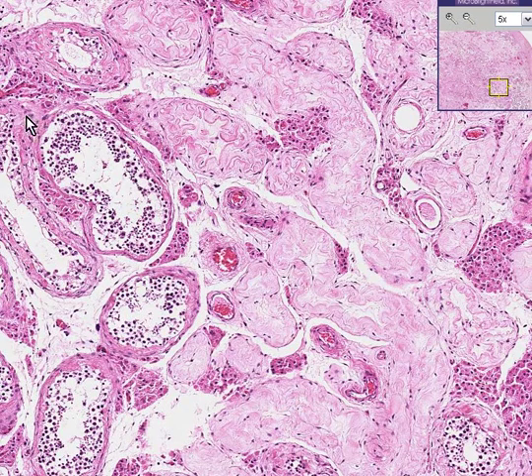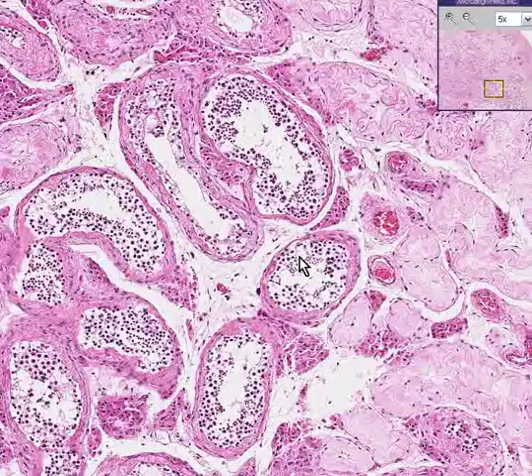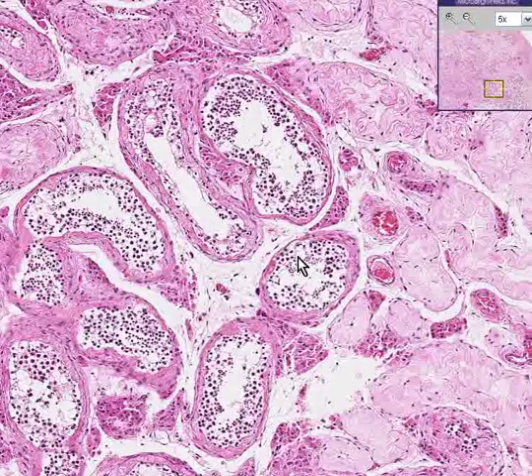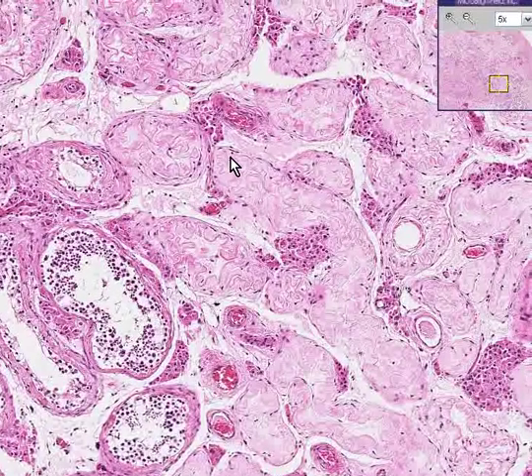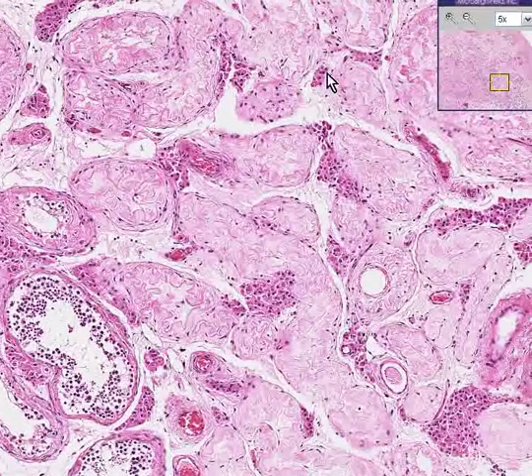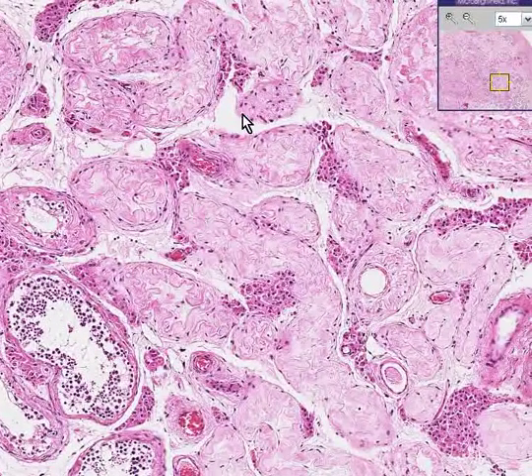Well, these are seminiferous tubules of the testis, and here's a few that are not hyalinized, but the majority of them are.